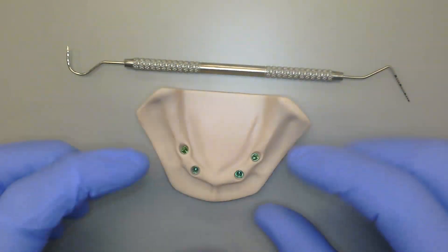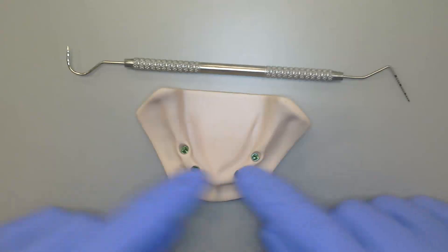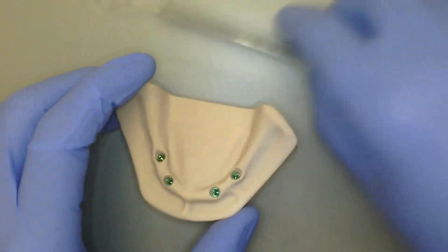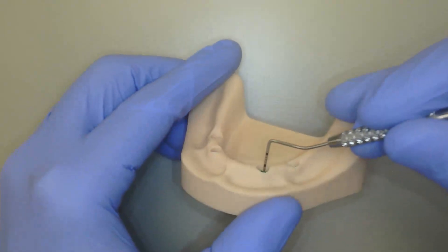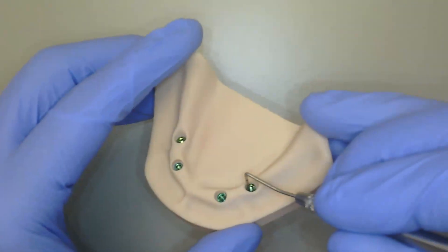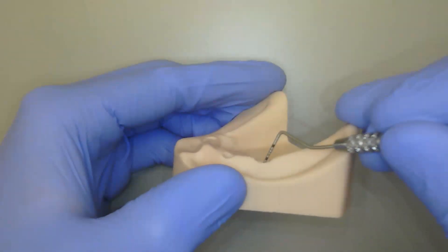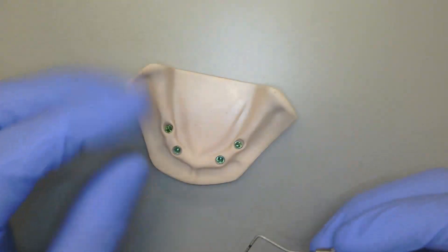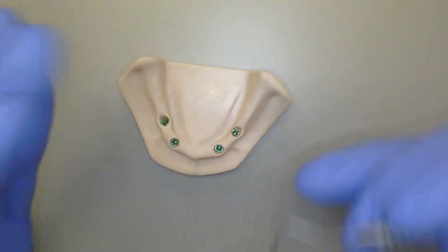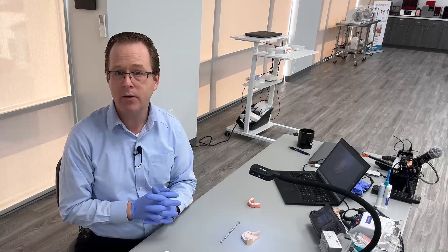Step number one is to measure the relative angulation of these implants. Since I've already removed the healing abutments for this case, you can take a periodontal probe, place it into your implant, and get a general idea of what your angulation is. You can see here I've got about a 15-degree tilt on this one, and this one is pretty parallel. Now, the proper way to measure soft tissue depth for your locator angled — let's backtrack a little and talk about how to measure soft tissue depth for your standard locator abutments first.